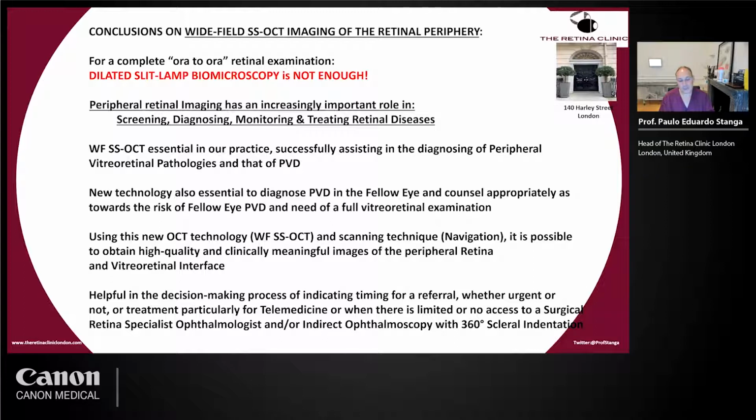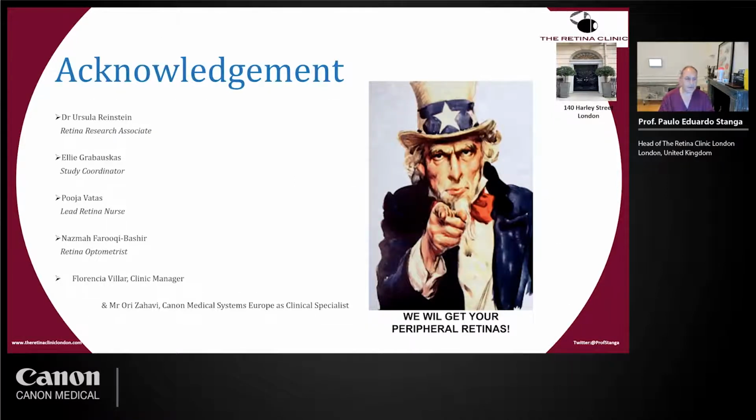This technology, in our opinion, is helpful in the decision-making process of indicating timing for a referral, whether it's urgent or not, or treatment, particularly in an era of telemedicine, or when there's no access to a surgical retina specialist, or indirect ophthalmoscopy with 360-degree scleral indentation.